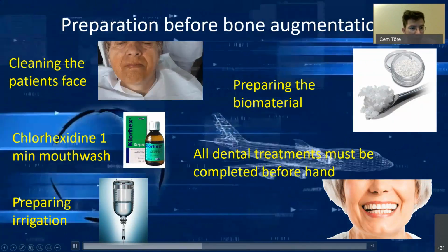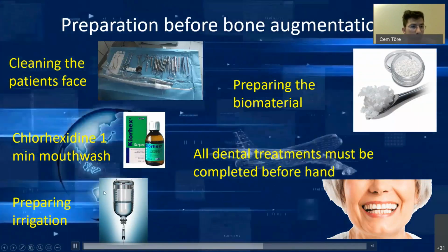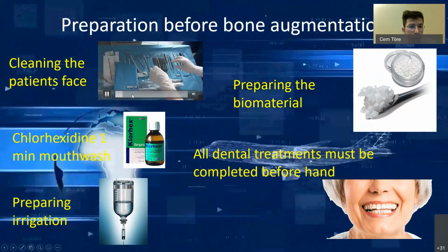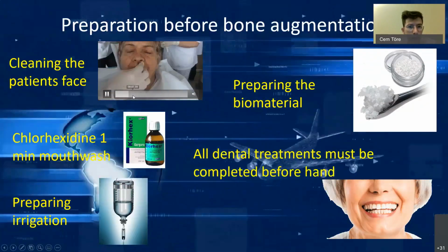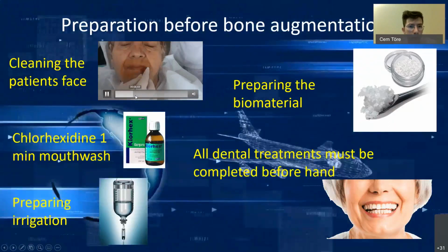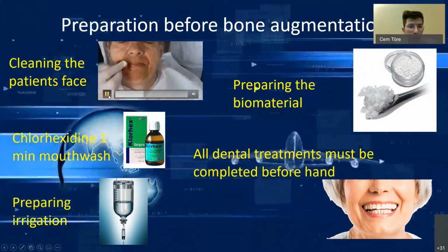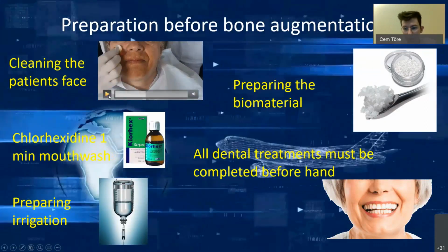We prepare our biomaterial. We prepare our irrigation. Plenty of irrigation will be needed. We clean the patient's face with an iodine solution, which is especially important with male patients with facial hair.